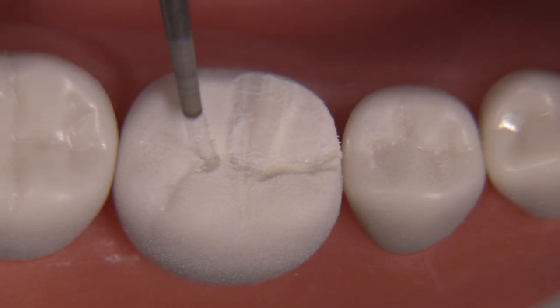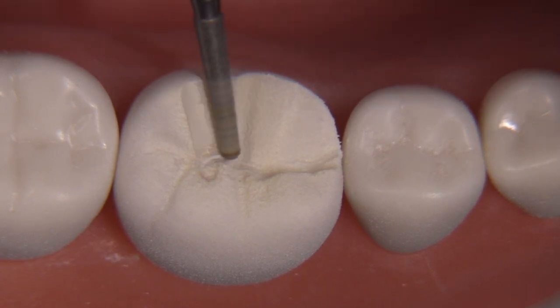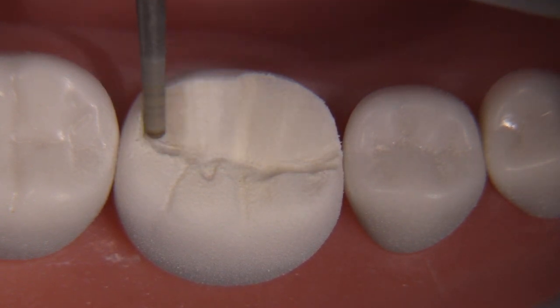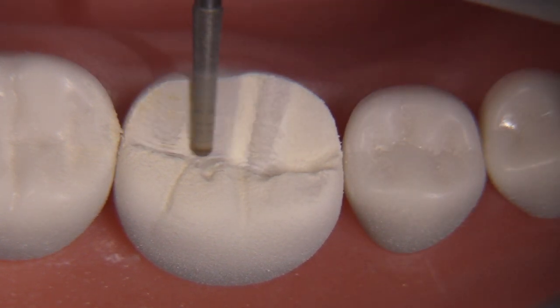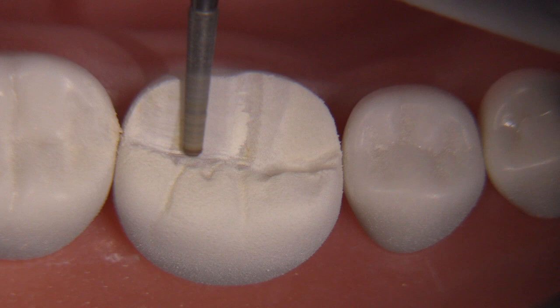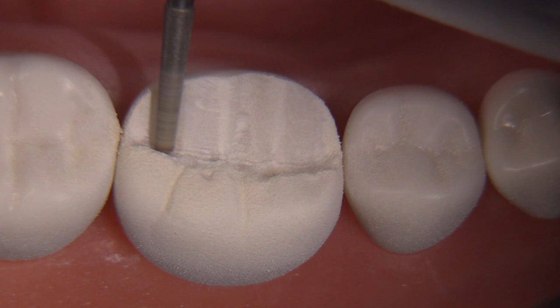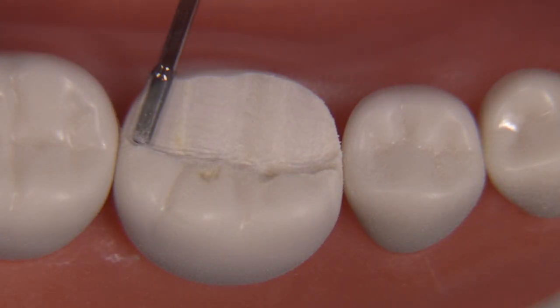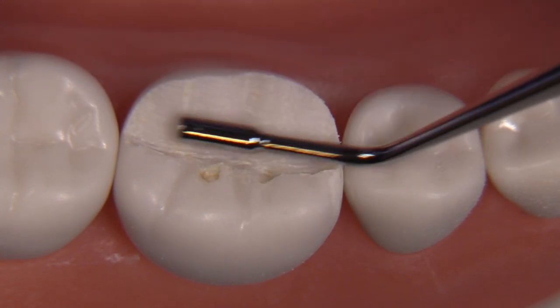Once we're done with the mesial lingual cusp we'll migrate on to the distal lingual cusp and perform exactly the same function across the C plane. This non-functional cusp reduction is not done flat — we're doing it to mimic the triangular ridges. This diamond is getting a little worn out; I can usually resurface it and get a few more minutes of use, but it's just about had it. There we go — we're looking at 1.5 millimeters with the RGS4.